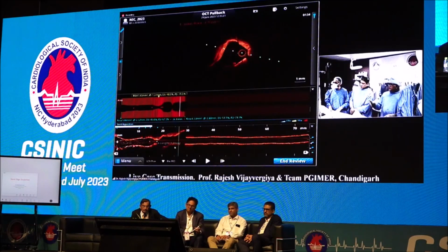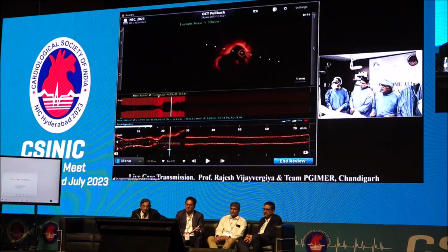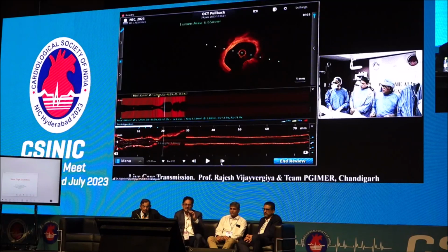Can you again demonstrate the left main? We do on the left. So these are the left main. You see the calcified nodule over there at the left main. Yeah, about 4 or 5 o'clock. Absolutely right, 4 o'clock, and the left main, which is again calcified.